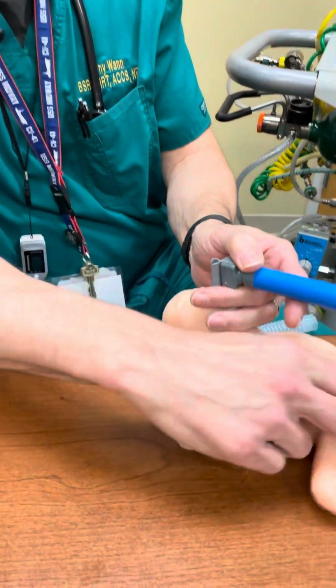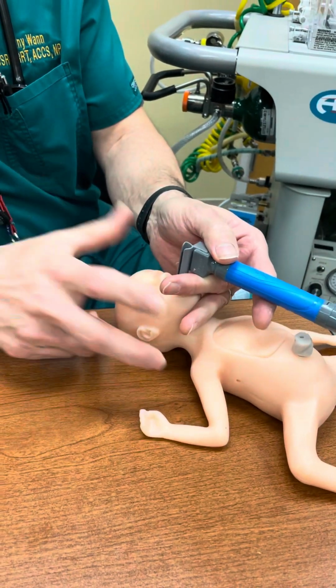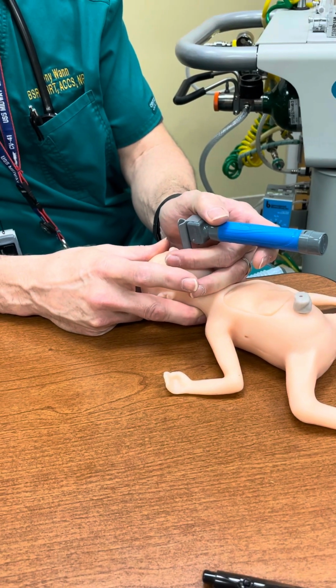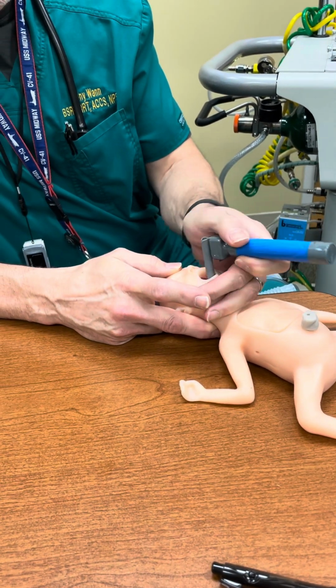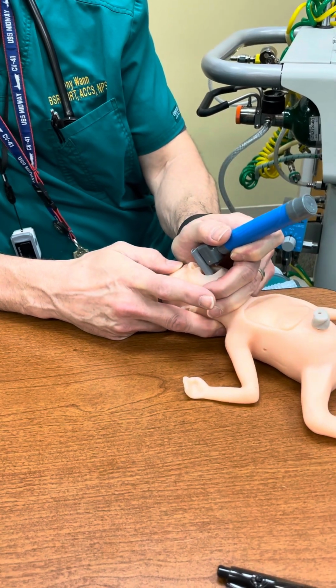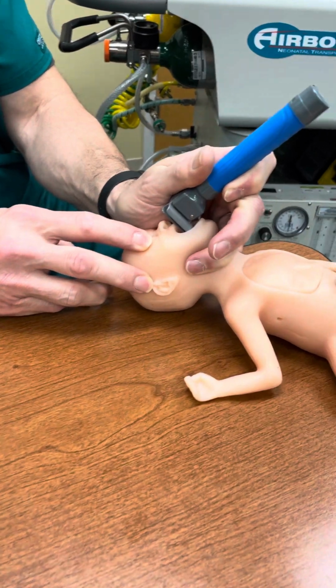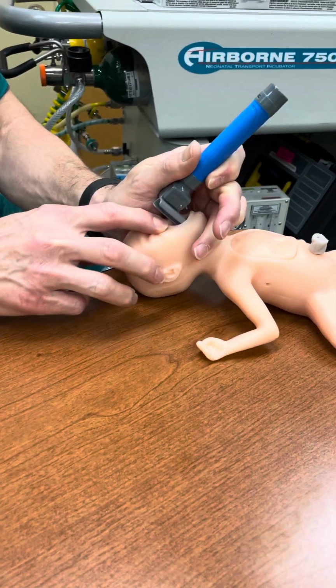Hold the baby's head as you're going in. You want to use your two hands at the beginning. This is what I call a one-person technique. And if you're going to do it by yourself, see how my hand's coming toward the baby's head? Now right here I have full control of the baby. And I'm off the palate right here.